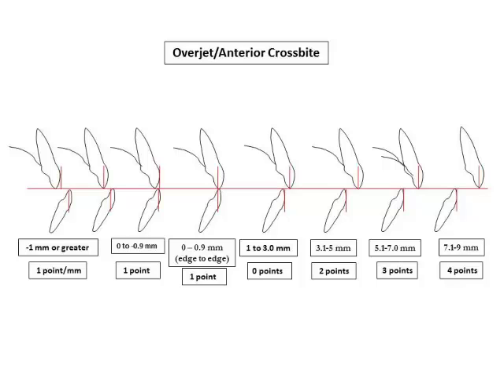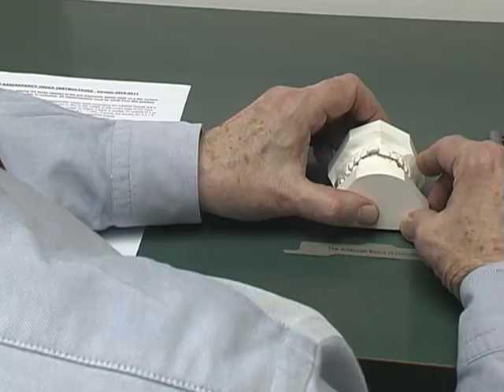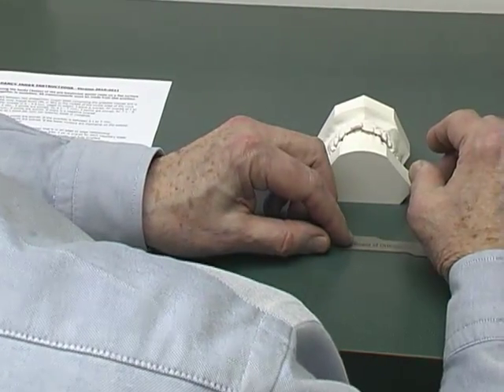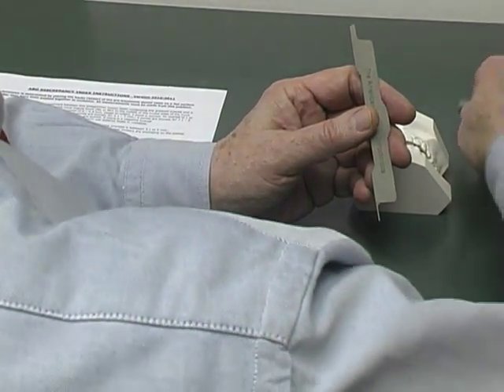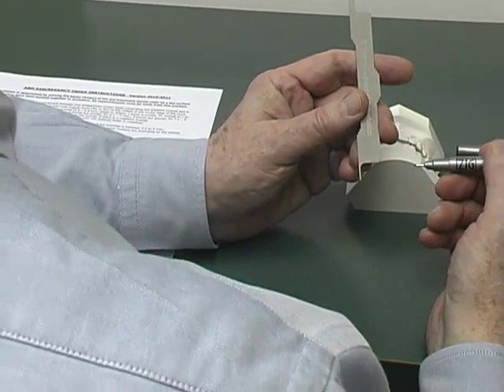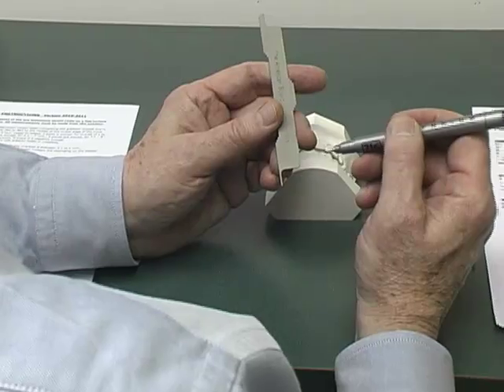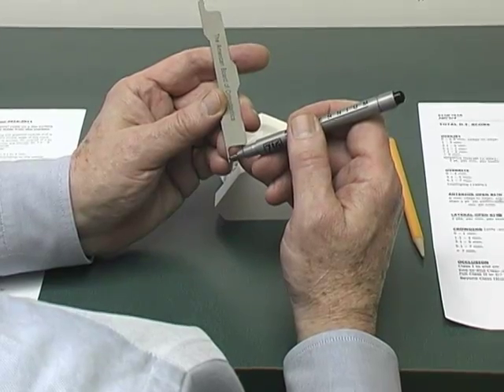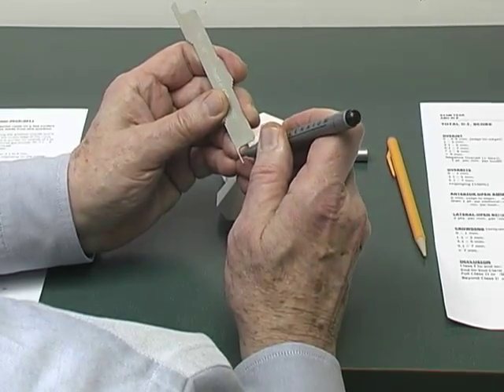I will begin with a set of casts, number 2, that are not that severe but will allow me to demonstrate measurement of a couple of categories. Before I do a DI, I will actually take the ABO measurement instrument and mark the 5 millimeter and the 10 millimeter so that I can more easily visualize the millimeter readings. I use a half millimeter black felt tip pen — naturally this isn't permanent on the metal, it will wipe off easily. So I will count 1, 2, 3, 4, 5, and mark.